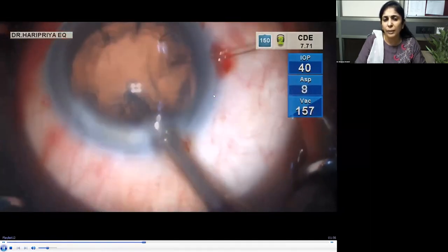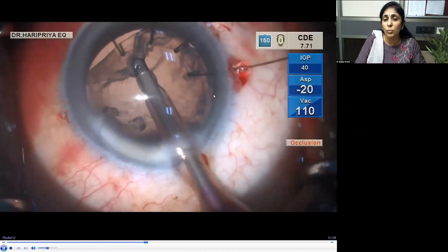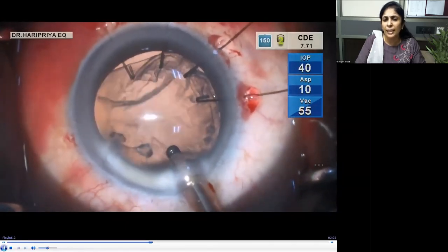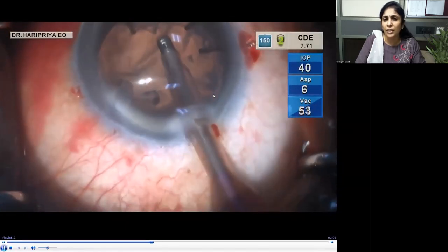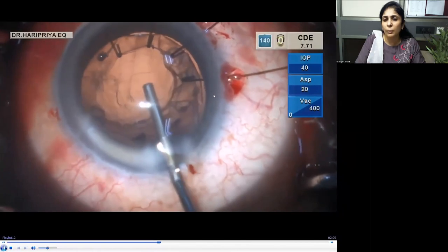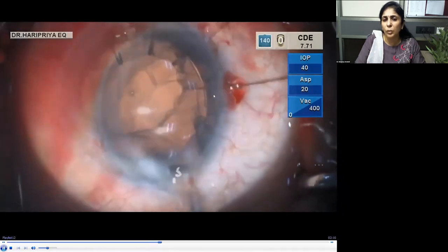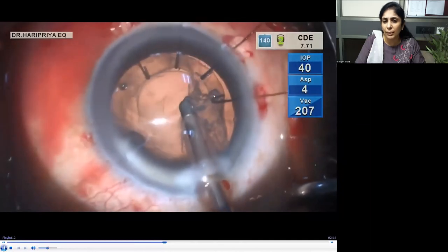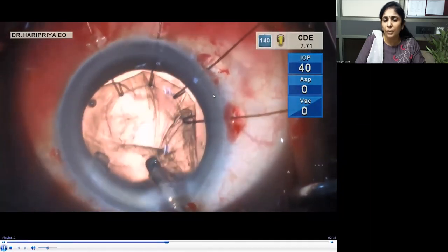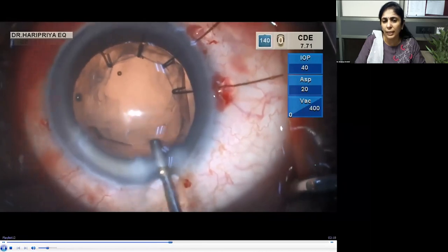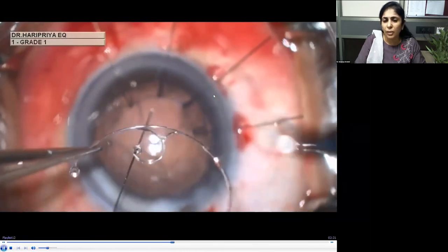Cortex aspiration can be difficult with weak zonules, especially without the CTR in place. With very gentle aspiration, and since there's no equatorial ring support yet, the fornix of the bag may come toward the pupillary center. You may need to inject viscoelastic in between a couple of times to ensure the dialysis does not enlarge.